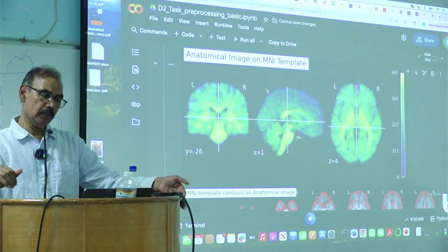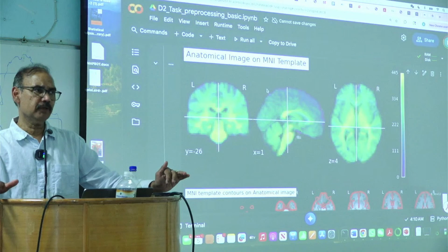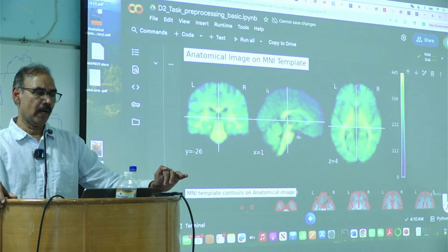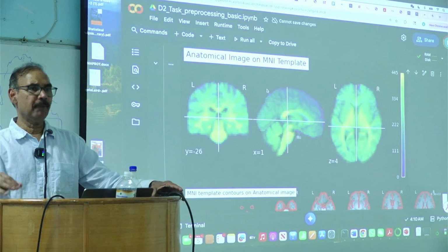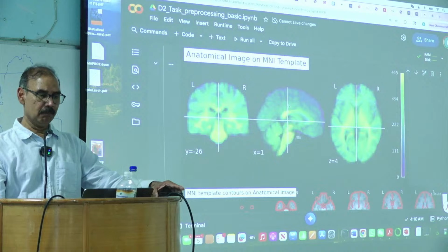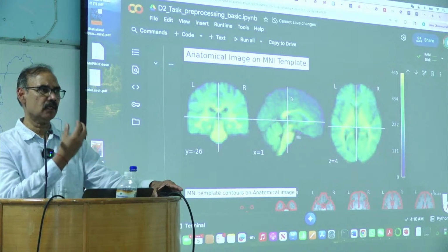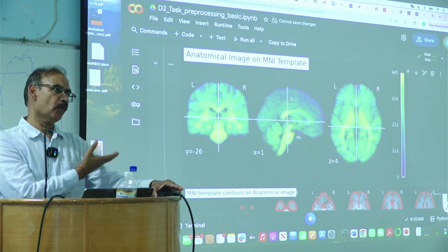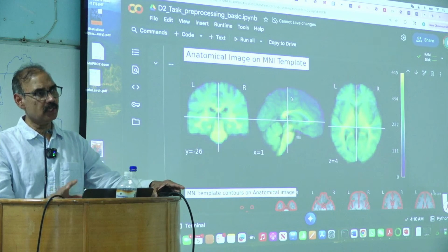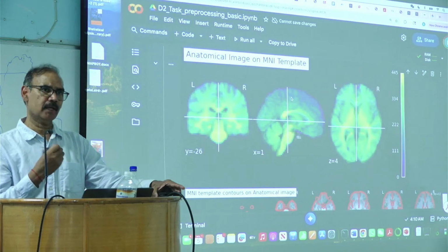So if you don't think there is a difference in the structural image, then it is okay to use. What I was thinking was more simple. Let's say you had done an fMRI on a patient with a brain tumor, right? So there's a blob somewhere here with high intensity. Now, if you're doing a transformation, that is going to provide a solution which is not optimal and may misregister it even more, right? So in clinical cases, you just have to be careful.